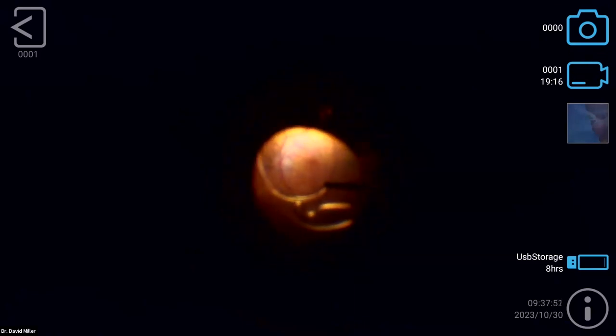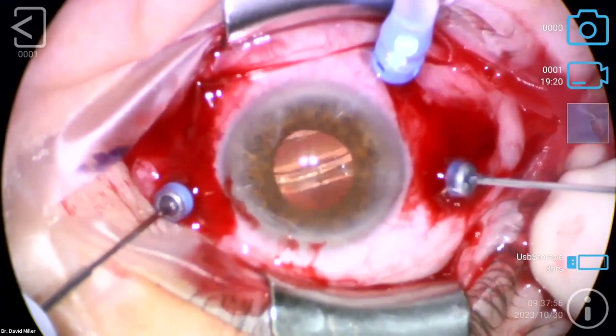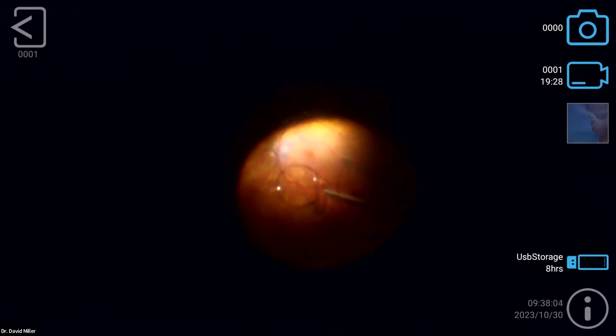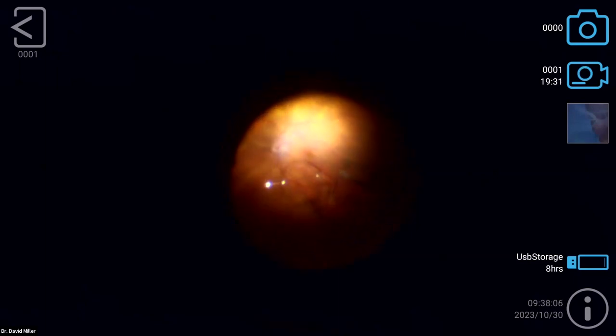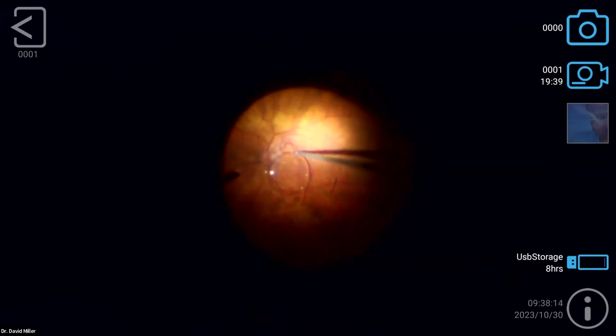So we just grab it like so. I don't care which orientation it comes up. You can pick that up. Yep. Now I'm going to take a pair of forceps. Also, we lost it. Let's pick it up again. So that's okay, and that's very common. What you want to do is, if we have to, we can always use forceps, like I said, but I usually find it not necessary.